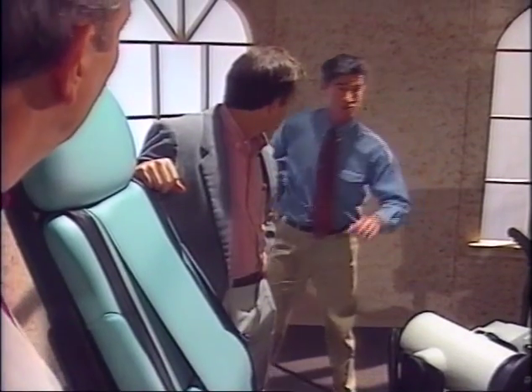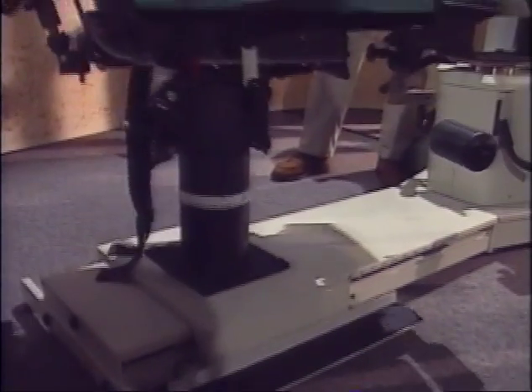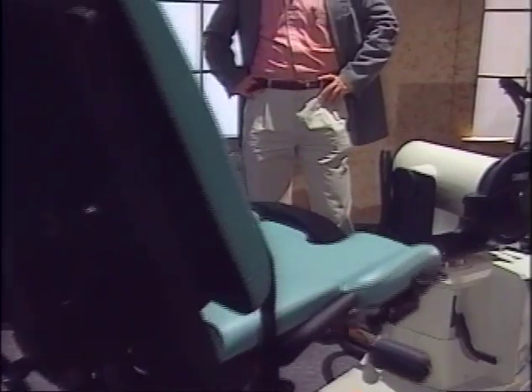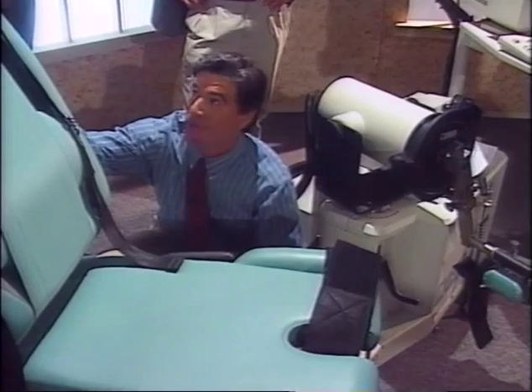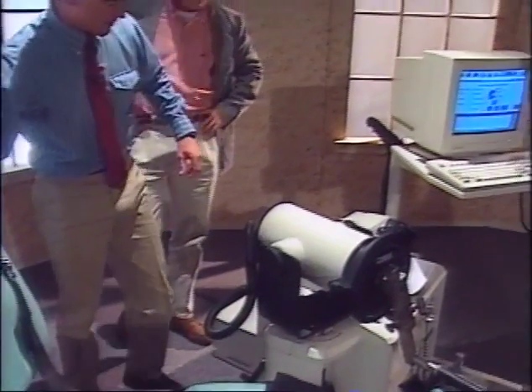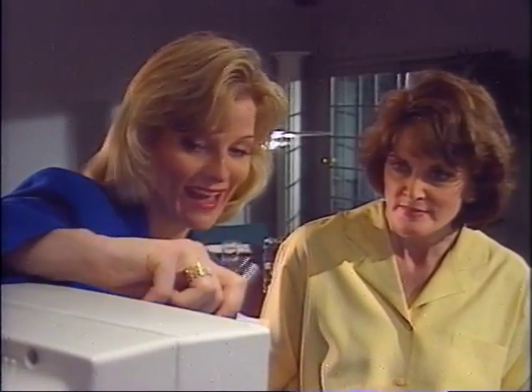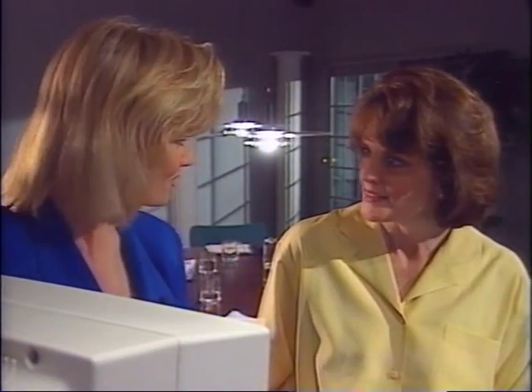All right, let me show you something else. Excuse me. Take a look at the seat adjustments. The Easy Glide positioning system makes patient setups a breeze. Everything is accessible from both sides of the chair. And the corresponding scales on the dynamometer and the chair ensure exact seat position every time you set up a patient. For added safety, we've also included adjustable range of motion mechanical backup stops. All patient information, including anatomical zero and range of motion, is stored and retrieved using Windows-based software.